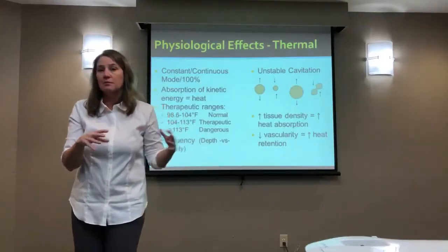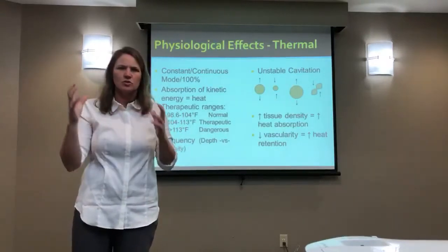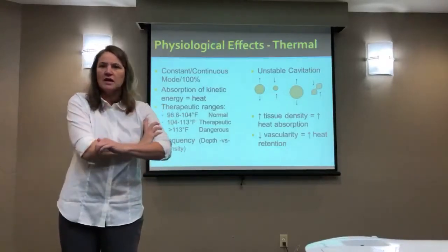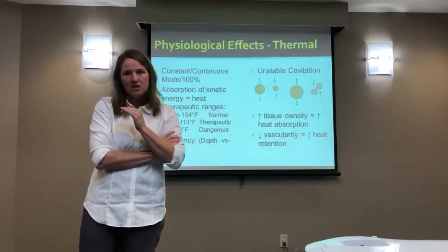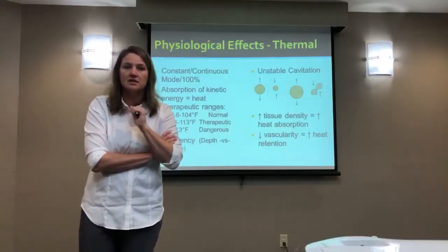And then certainly be prepared. As soon as you're done with your ultrasound, if you're going to do joint mobilization, which requires 2 hands, put your head down, clean up later, and go right into your joint mobilization technique and utilize the most optimal time to take advantage. That way you're using your modality to the best possible advantage.